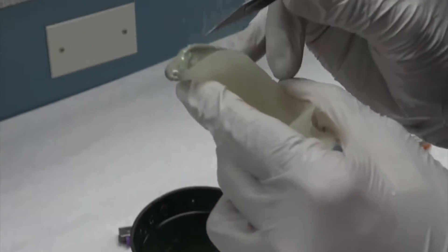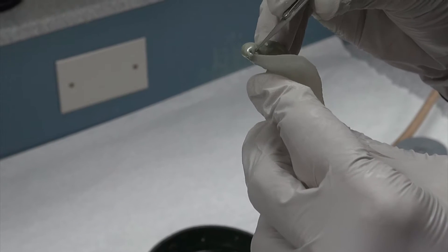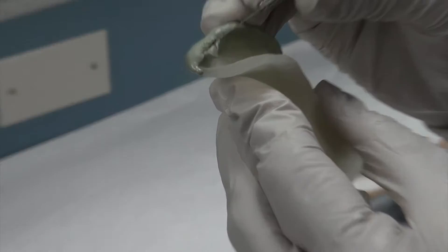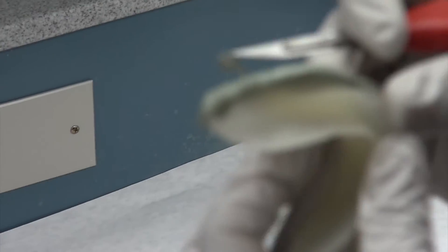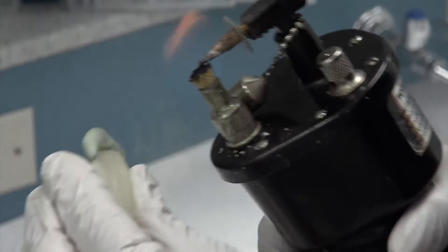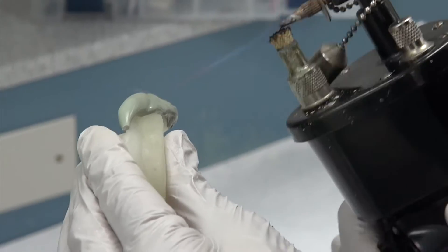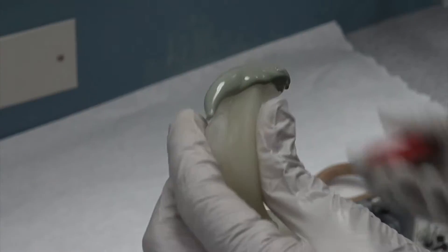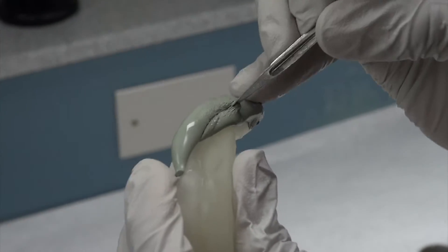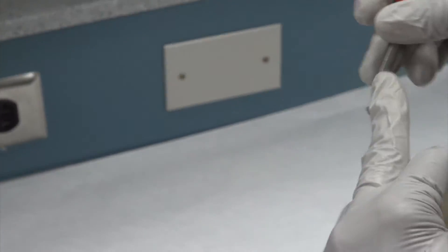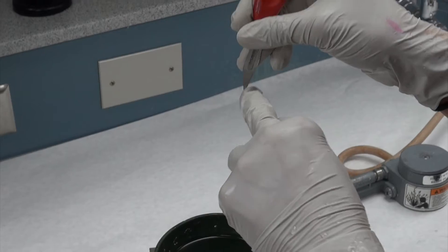So, you want to have it right on the edge. So, all of this can be removed. As well as this gross excess. And see how if you heat it, it's very easy to manipulate?